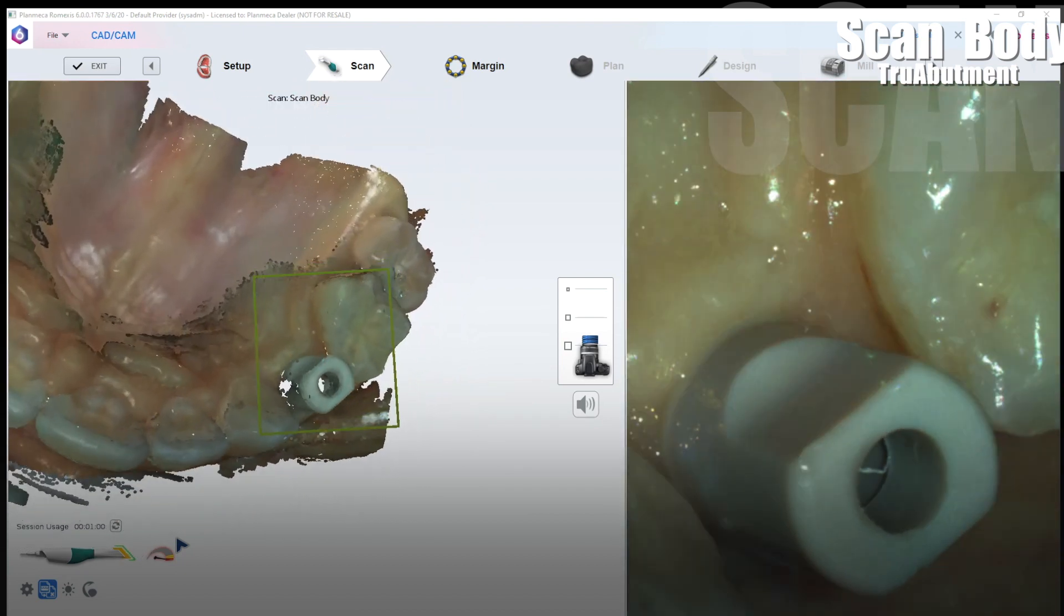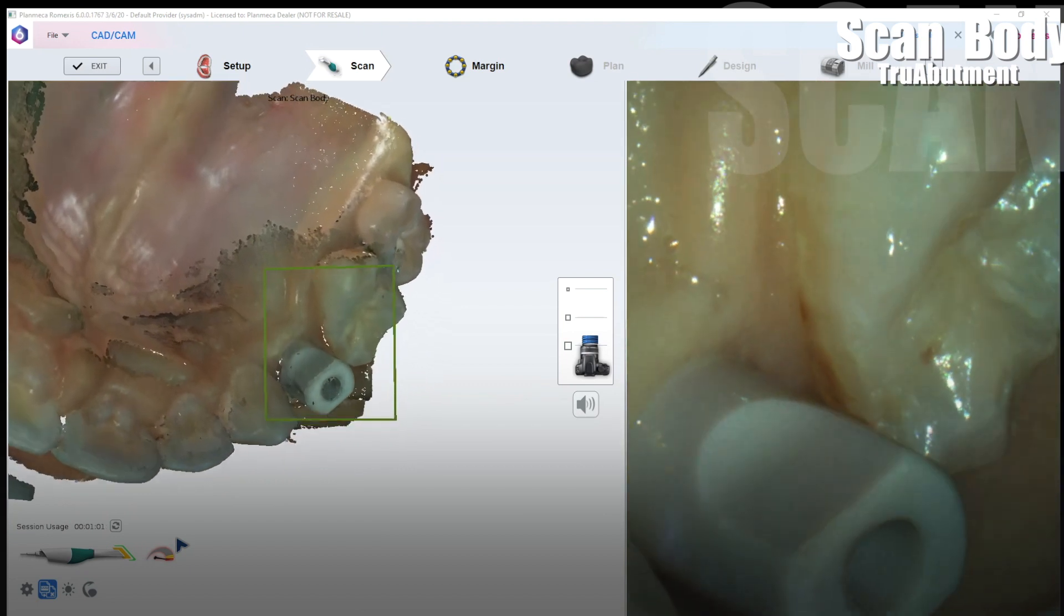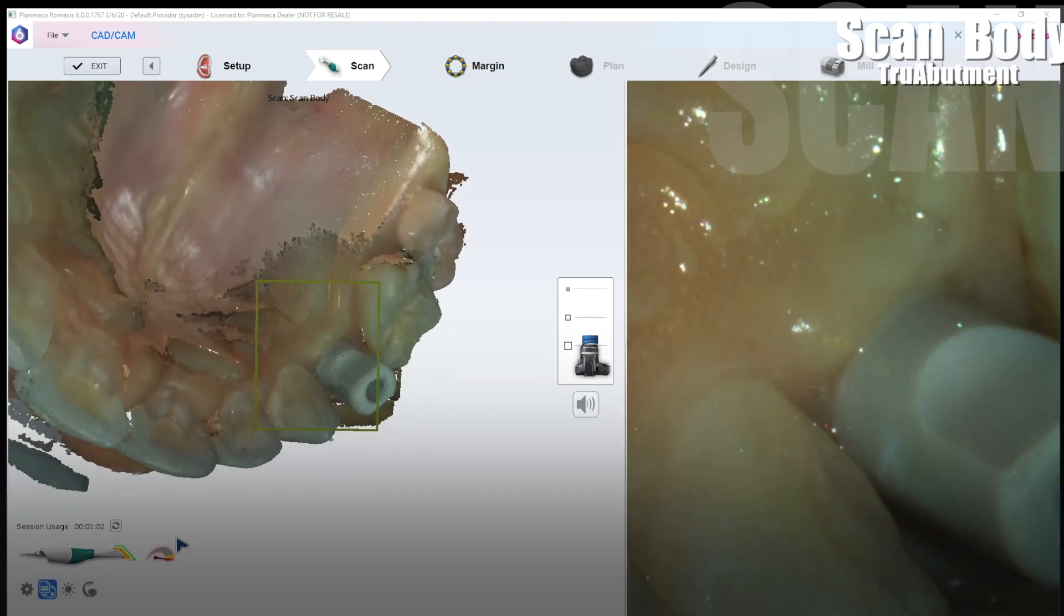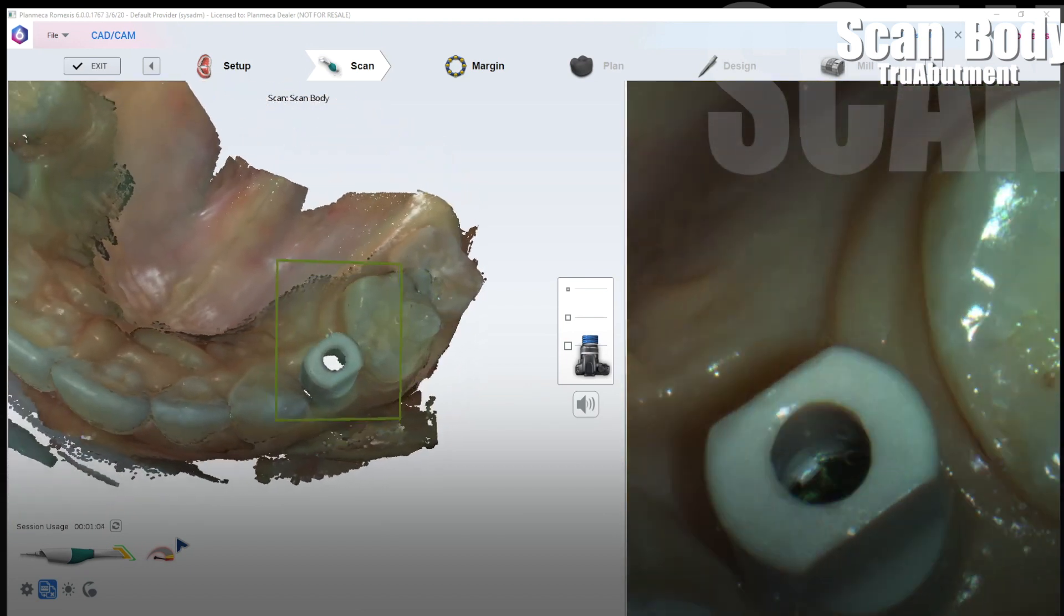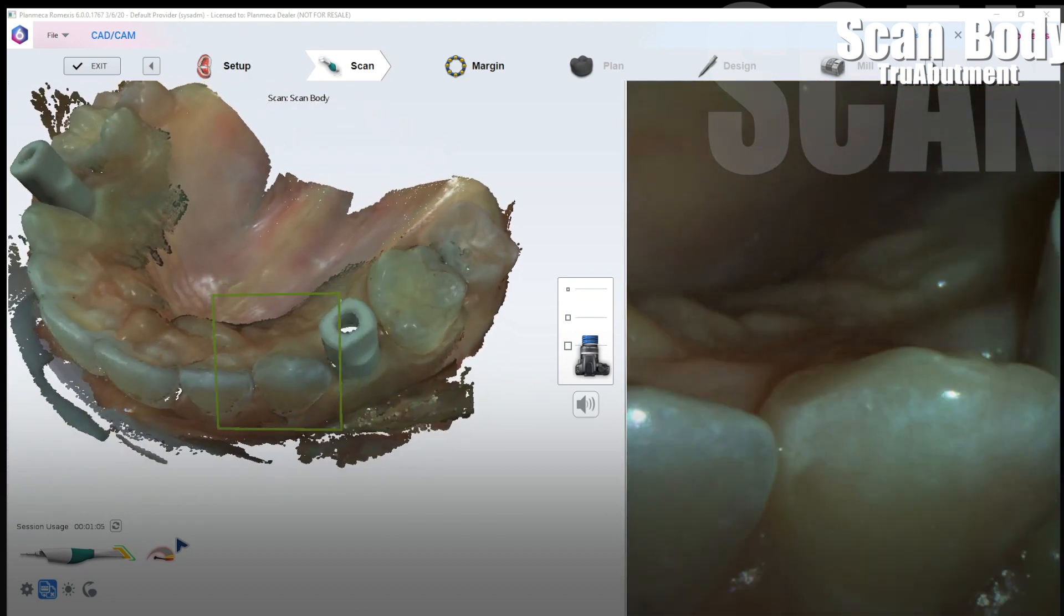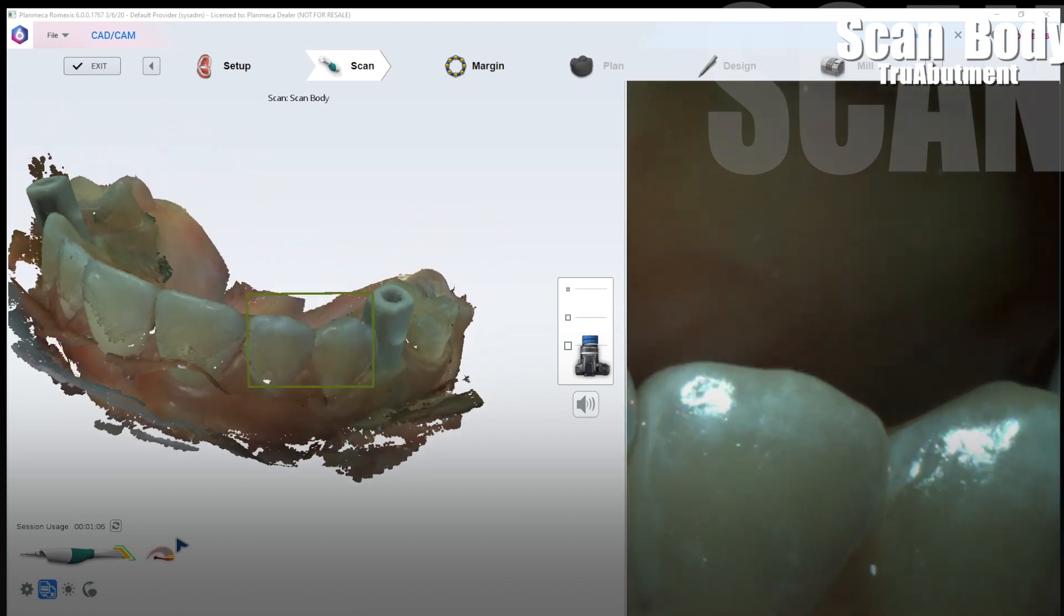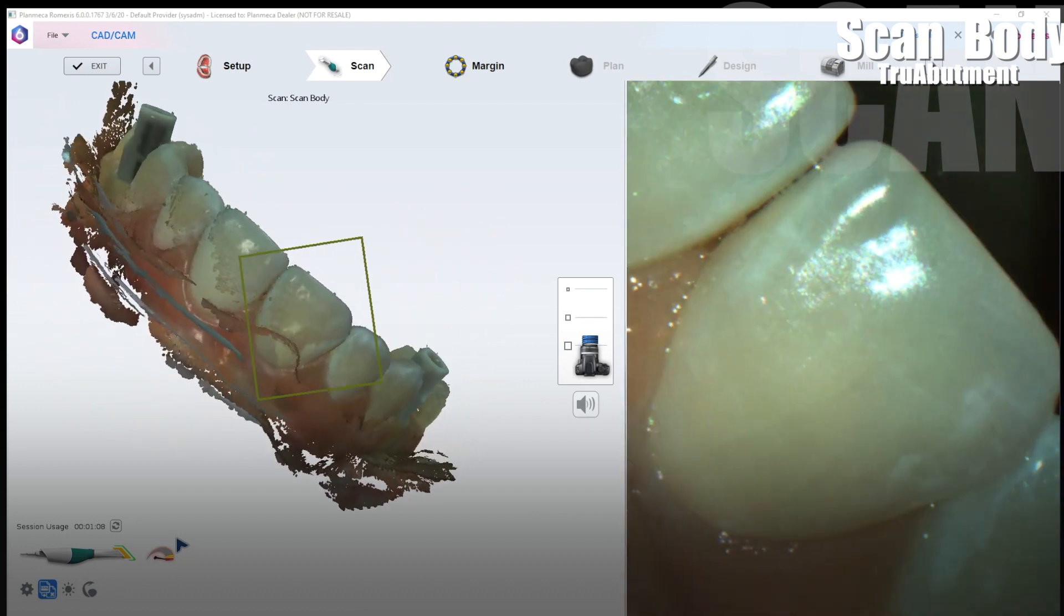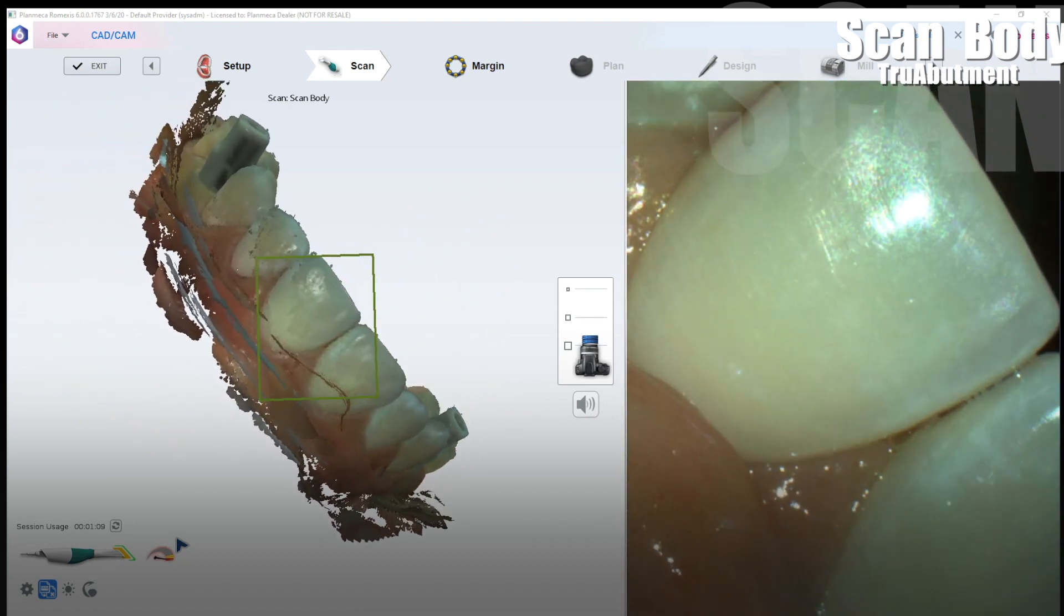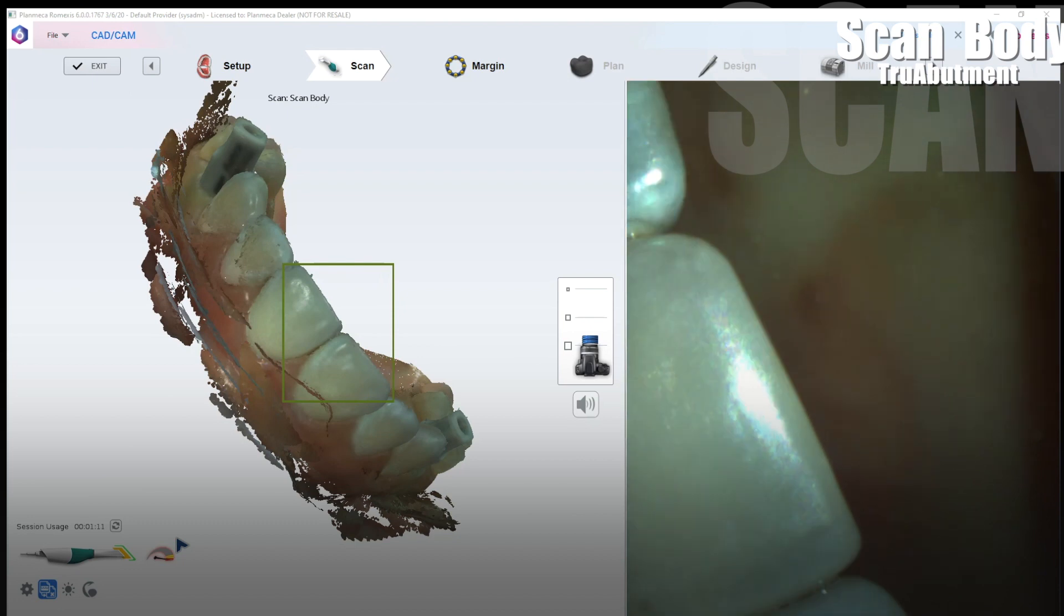Rotational based scanning, making sure to fill in as much of the scan body as you can. Once again your gingival scan already captured the proximal contacts of the adjacent teeth so you don't need to capture that.